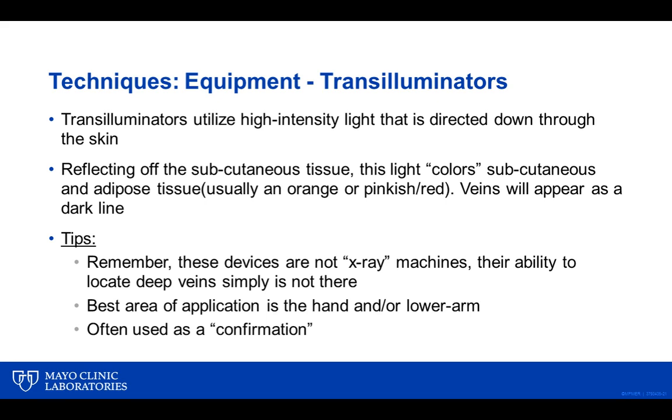And again, depending on the type of illuminator in use, it may appear as a dark line, it may appear as a green line, depending on the type of light that the device uses. The thing to remember about these devices, particularly the smaller ones that are often used in peds, they're not X-ray machines. Their ability to locate deep veins simply isn't there. As I said, a lot of them, especially the handheld units, are more of a confirmatory tool.